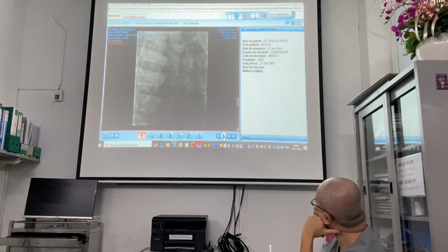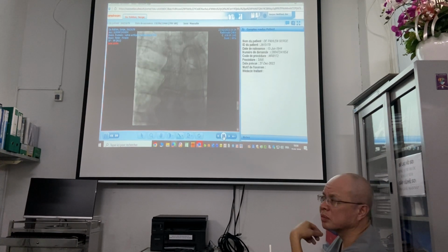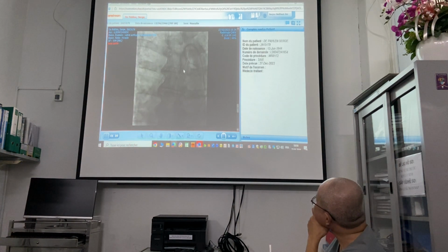Are you ready to look at this? I show you. So crazy. If you look carefully, the valve is moving up and down and is spinning around this axis, like this, doing like this all the time. You see that? So I tried to snare it again, which was quite easy. And this time I can snare the valve here.